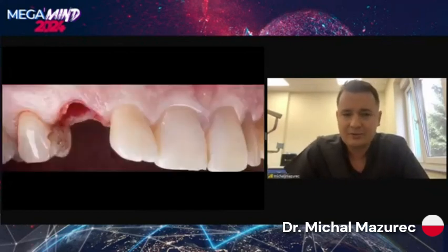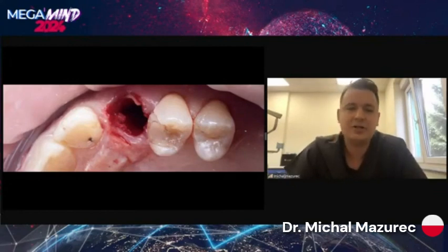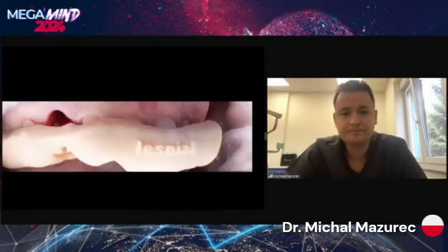So this is how it looks after removing. Now we have to prepare the shield. We use, of course, the Howard Gluckman kit, which is the best tool you need to do partial extraction therapy. As you see here, it's separated. We have to go at least to the bone level and then make an S shape from the root. We place here a 4.5 diameter implant with a 3.8 core, 15 millimeters, to get good primary stability, a high ISQ value due to the big bone-implant contact.